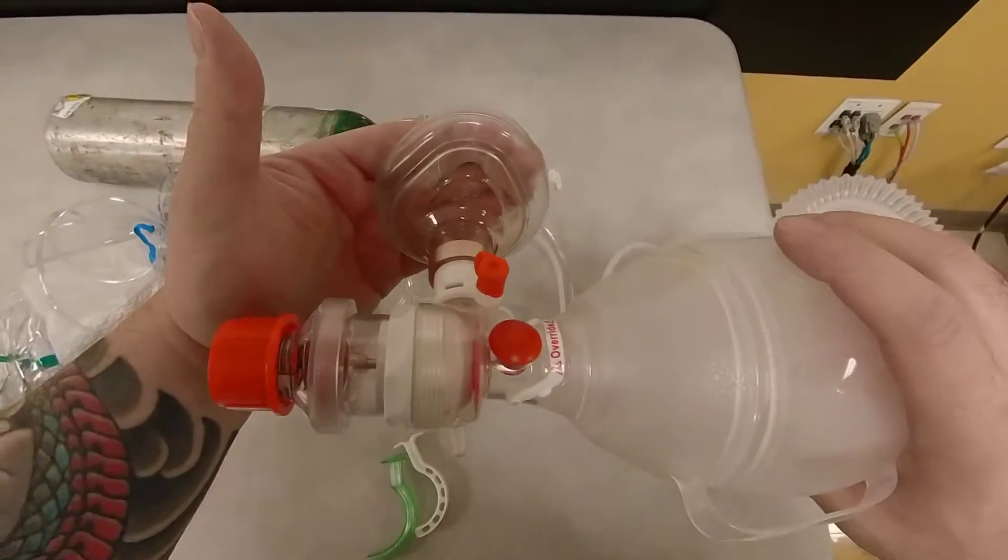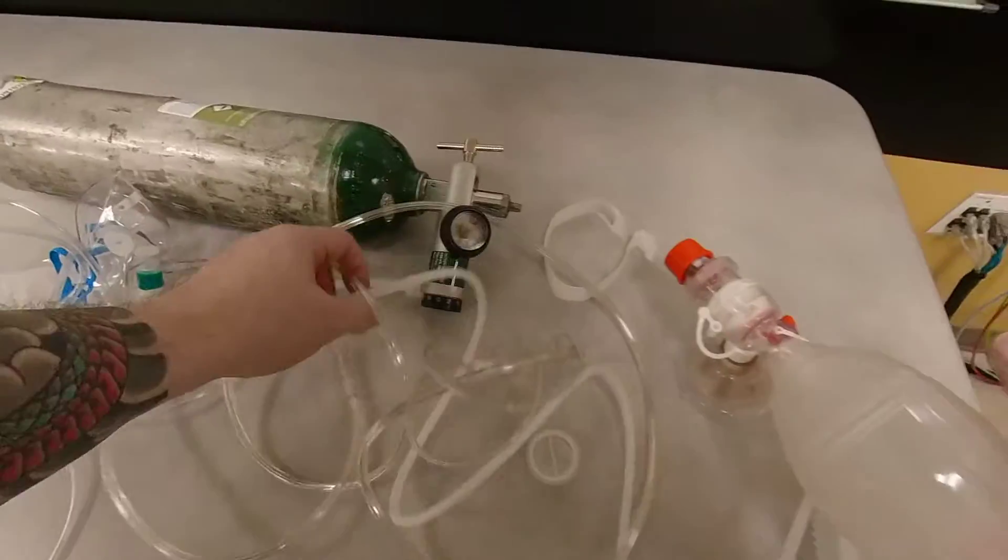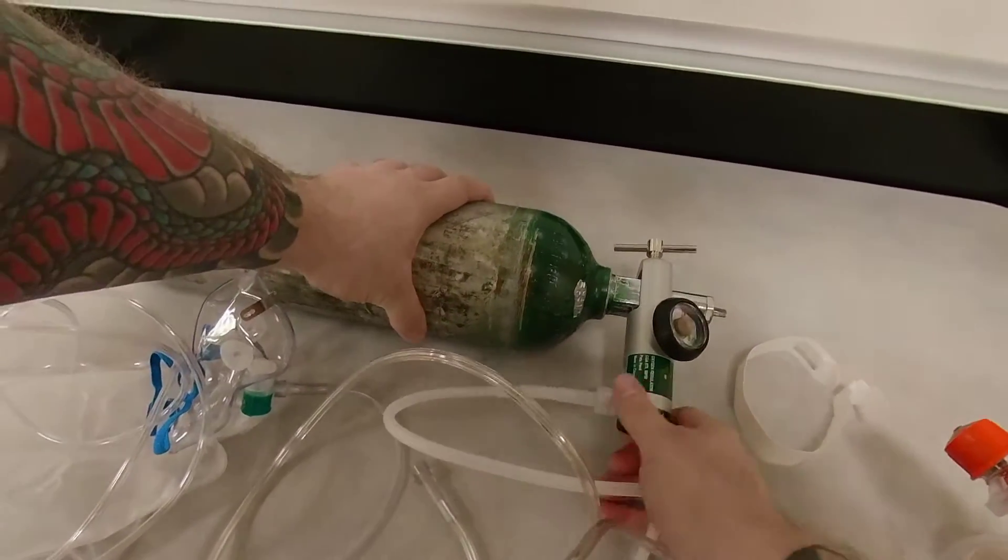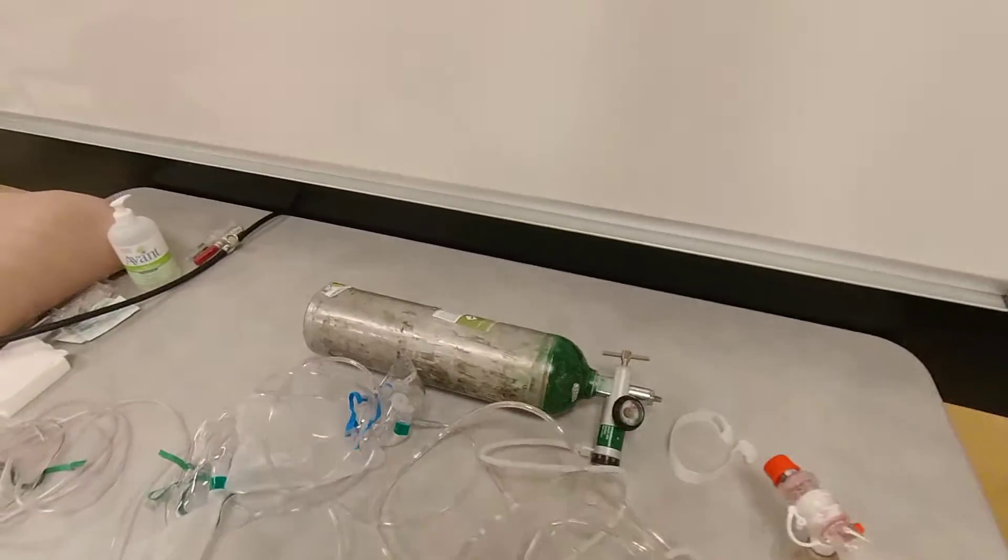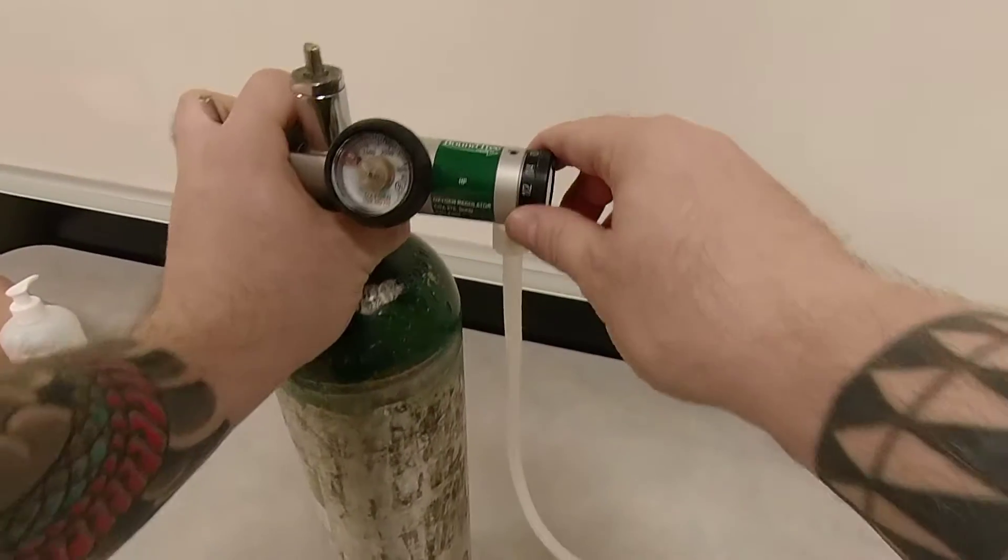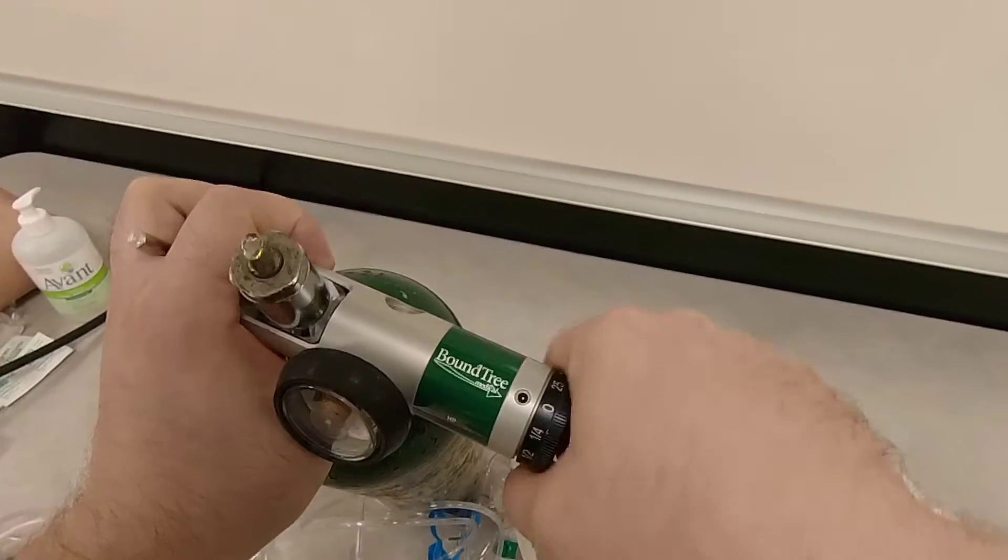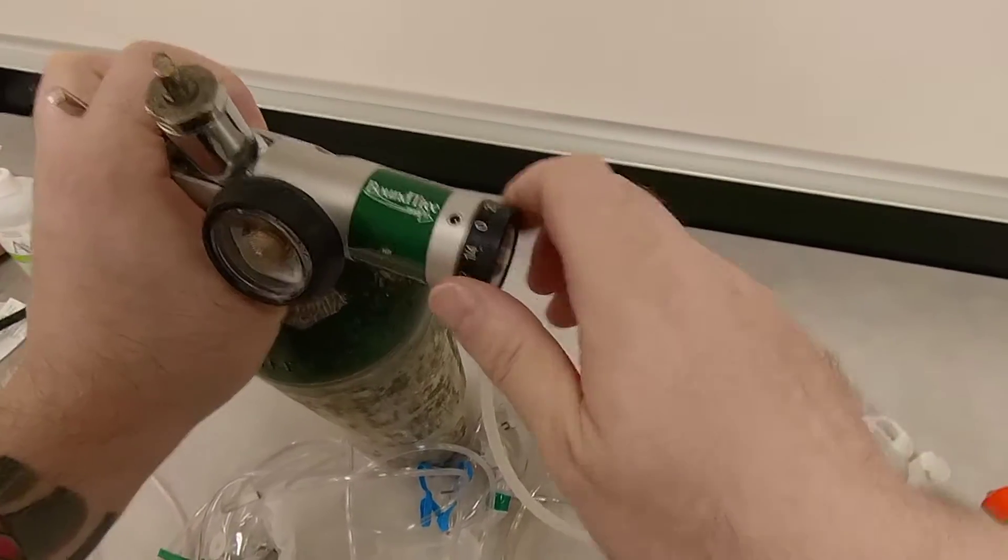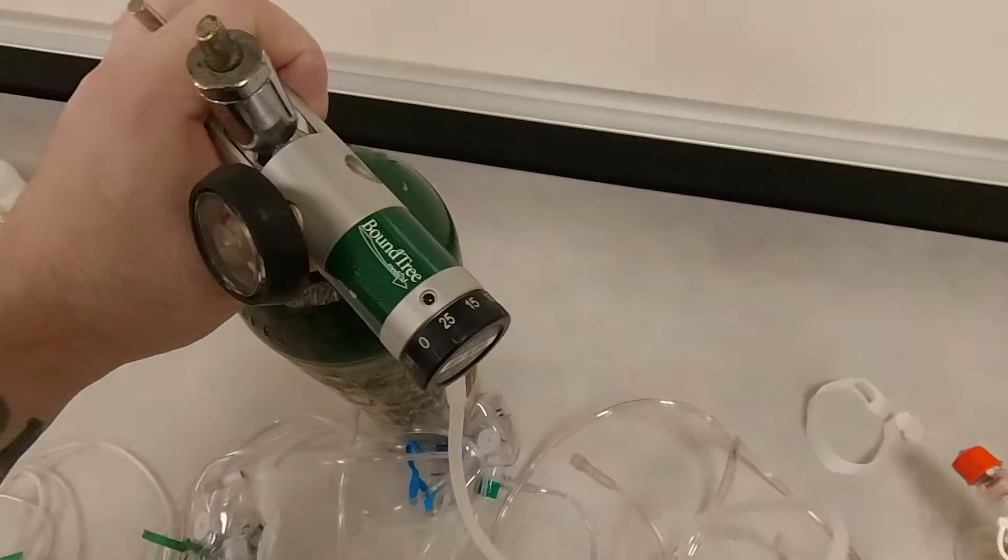Now, this device can give you greater than 90% FiO2 at 15 liters per minute. Now, they did a study in JAMA, and it was titled Flush Rate Oxygen for Emergency Airway Pre-Oxygenation by Driver in 2016. And what they did is they wanted to see if they increased your flow of oxygen. So they had oxygen regulators in the hospital that were able to exceed the 15 liters per minute. They were able to go above 40. And here on my regulator, I can go as high up as 25. You see it here.